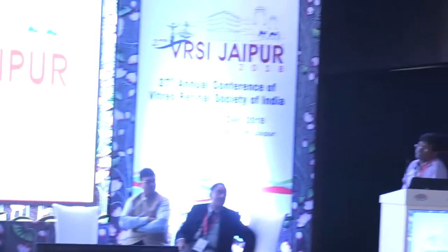Sure. The other issue with this is that when you're taking away the membrane, it strips some of the RPE. So do you always go for RPE transplant, or do you measure the RPE density post-operatively? No, I don't do the transplant. I just remove it, because what I see is that if I leave it like that, the whole complex itself is going to form a disciform scar. Even if you give TPA, the blood clears off, but the central part scars. So you're removing a much larger complex, and the actual photoreceptor damage area is smaller than the whole complex itself. If you remove it in one go, then only that central part remains damaged. But I have not been transplanting.